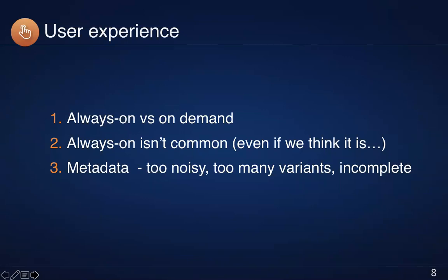For example, in mammography, because it's a narrow use case, it's easier to define for the machine what exactly it should analyze. But if you want to create a broad AI, a comprehensive suite of tools, we actually had to develop a whole other layer of extracting insights from images and metadata.